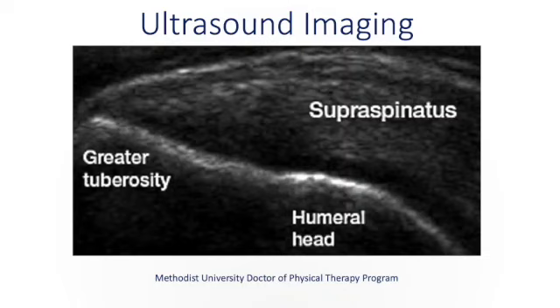Looking at diagnostic ultrasound imaging, this is a really interesting imaging modality because, as we're going to see with the live Blackboard Collaborate session, ultrasound has become very cheap, very accessible, and also very integral to MSK imaging and physical therapy practice. So we're definitely going to take a long look at ultrasound imaging because I think this is one of the imaging modalities that we really can use clinically.